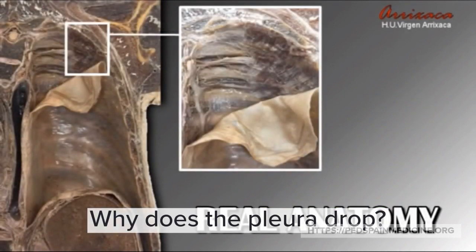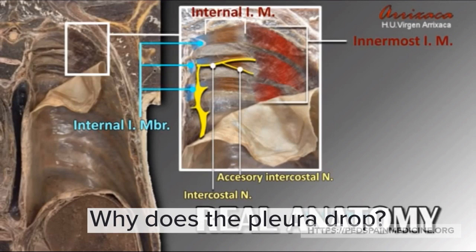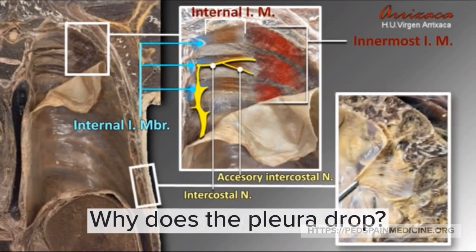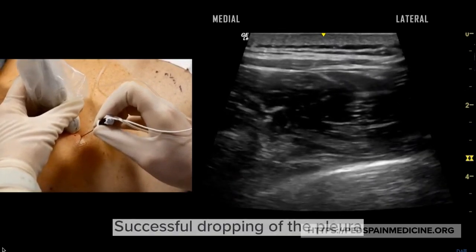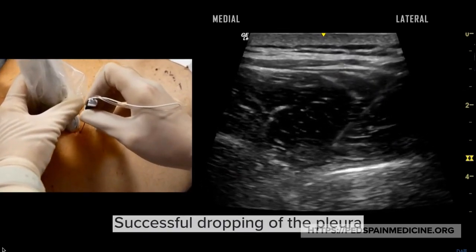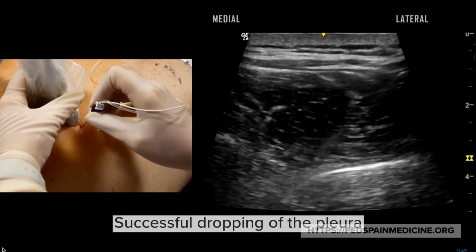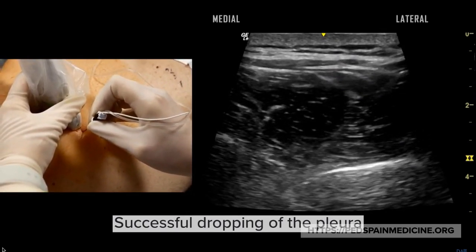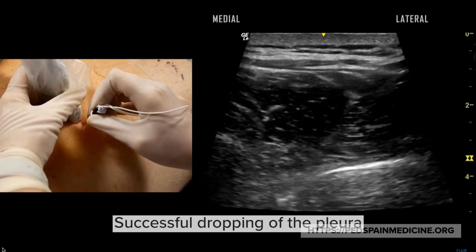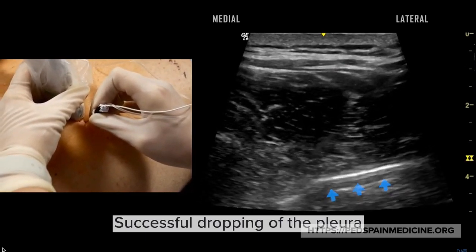Here is a video of a paravertebral nerve block showing successful dropping of the pleura.